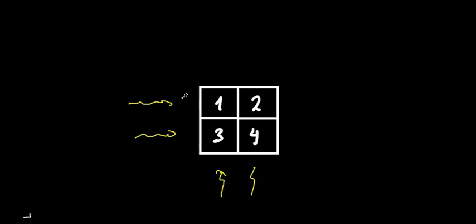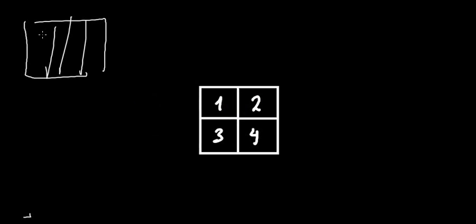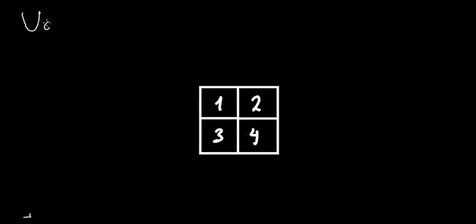And just so you know, when I take a given material and I divide it into these squares that are even in size, these are called voxels. I'm going to go ahead and put it right here just so we know what we're talking about.